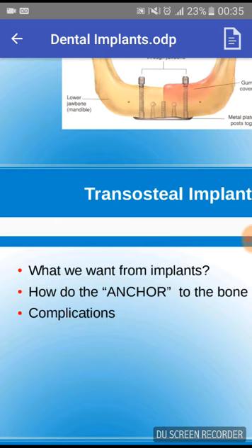So you have high yield strength. When the load is placed on the implant surface, there must be minimal permanent deformation, right? So as I mentioned before, the implant itself must be placed correctly or else it will result in a failure of the implant due to incorrect dispersion of forces.